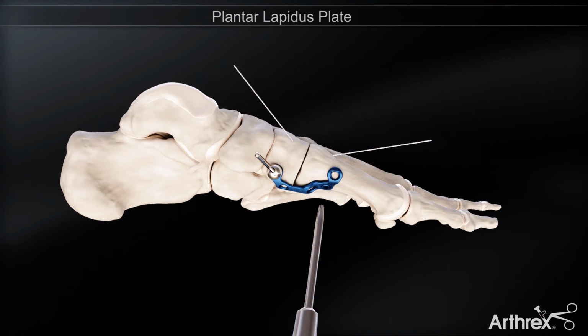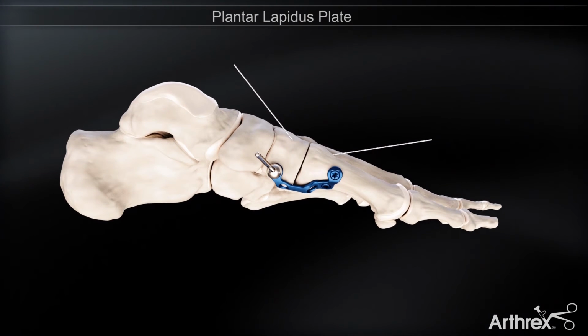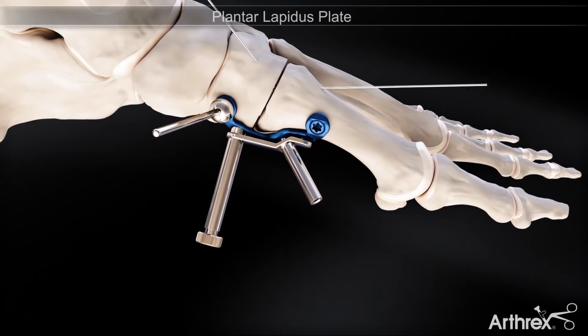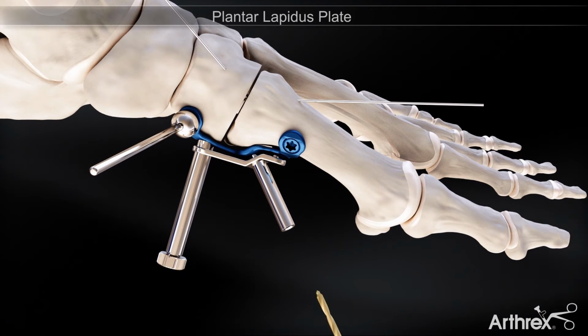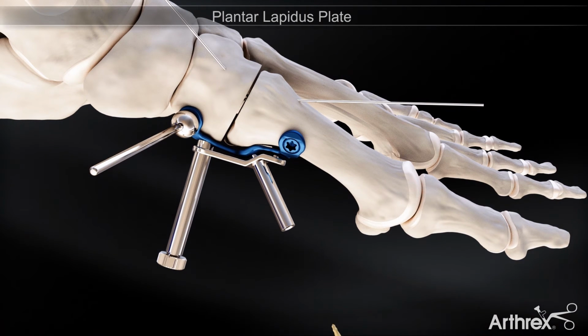Insert a second 3.5 mm locking screw into the distal hole in the plate using the same technique as previously highlighted. Next, the optional aiming guide can be used to drill for the interfragmentary 4.0 mm screw. It is secured into the locking hole in the proximal aspect of the plate and drilled with a 2.5 mm underdrill.